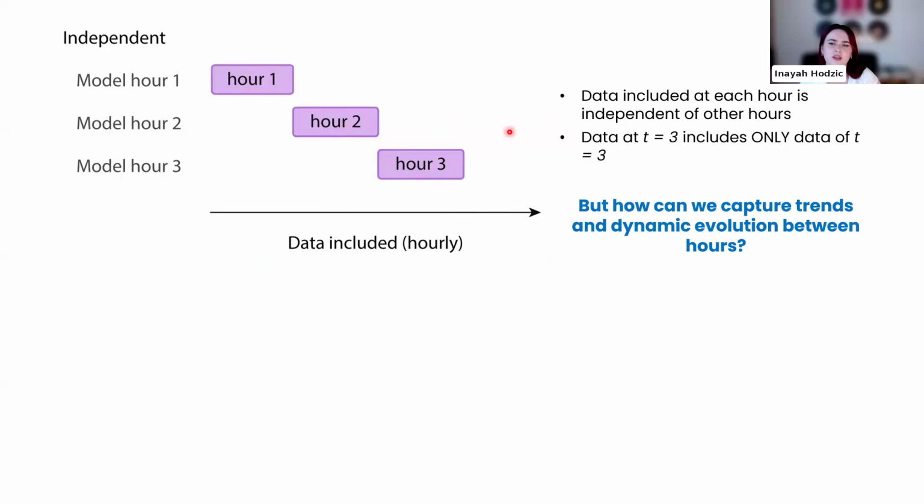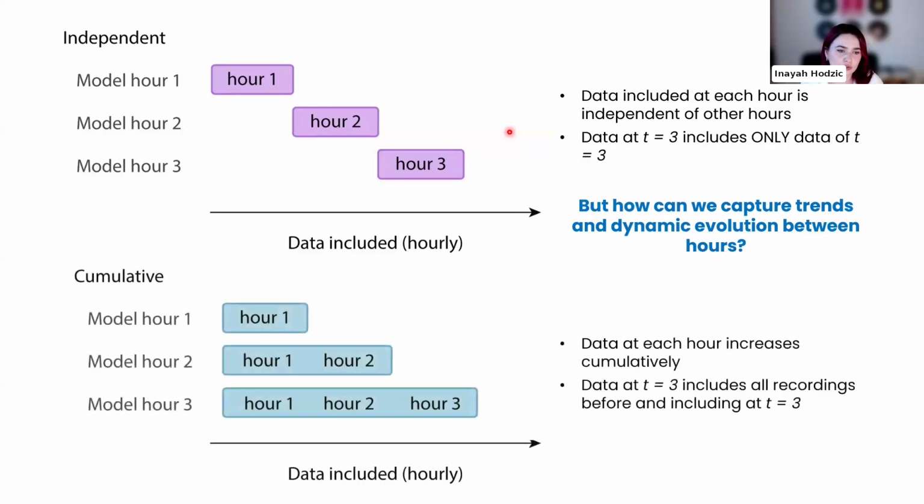So in order to investigate that further and see how we can alter our approach to get a more all-encompassing view over how the EEG evolves over time, we created a second model. So we had 2, now we have 4 for each electrode configuration, and we call this the cumulative continuous CNN.